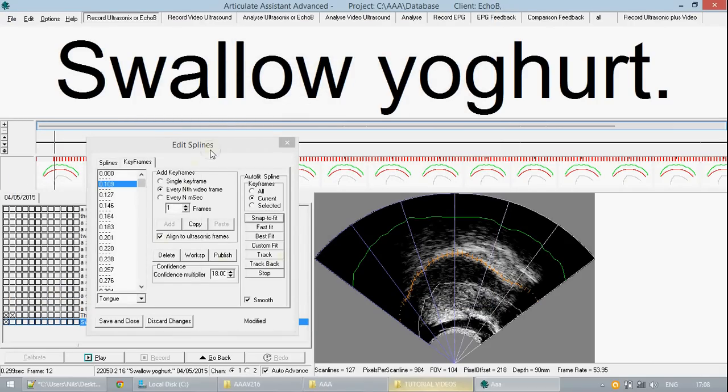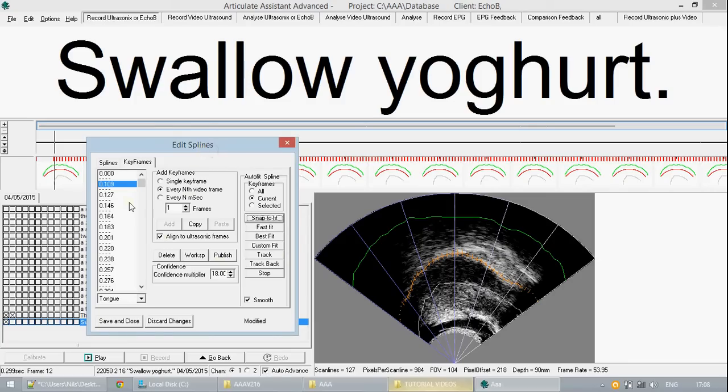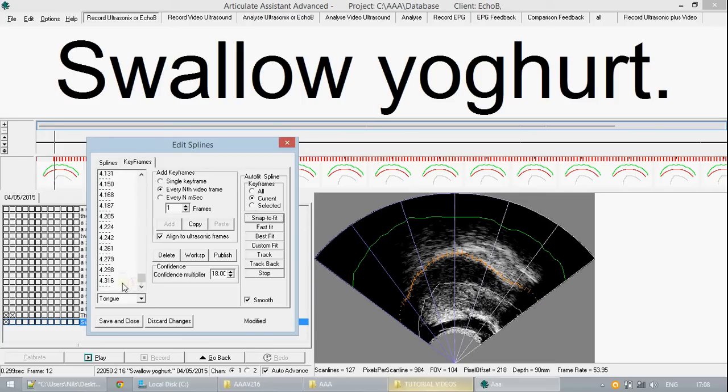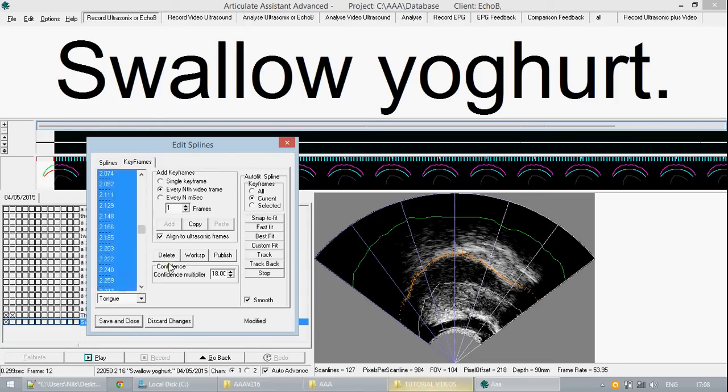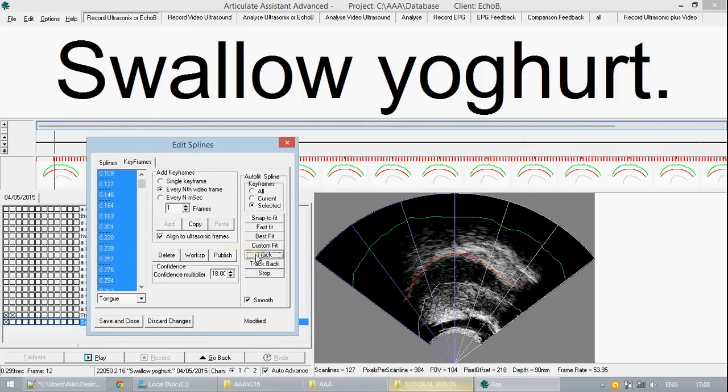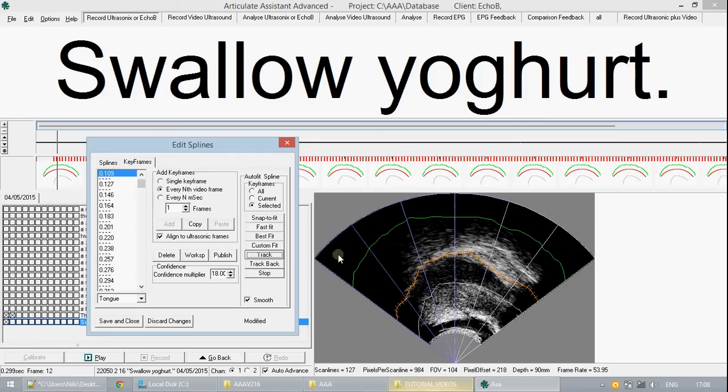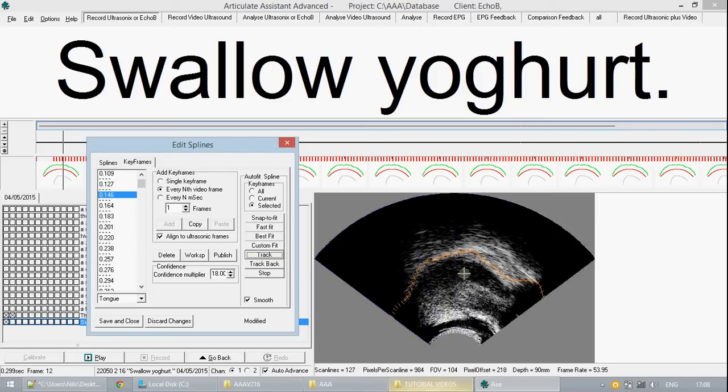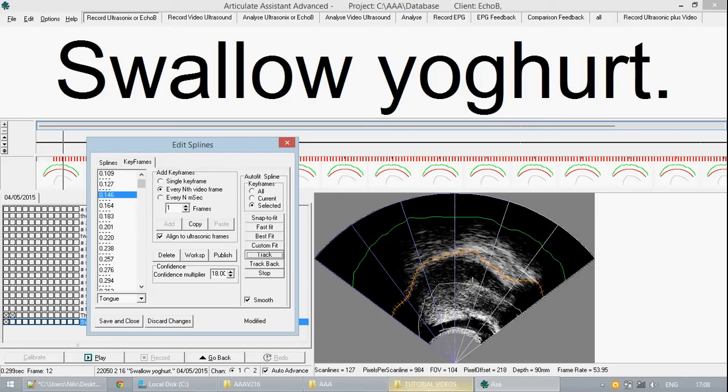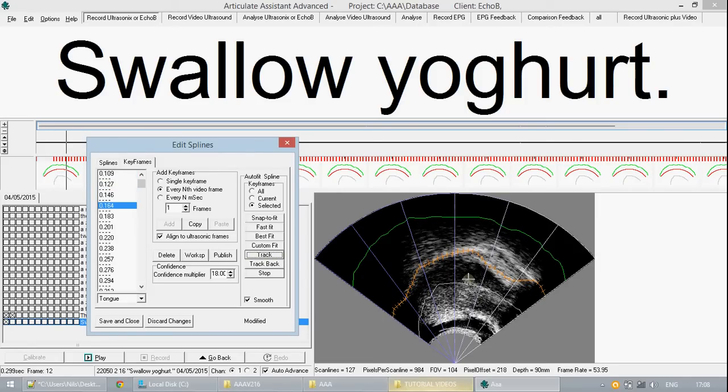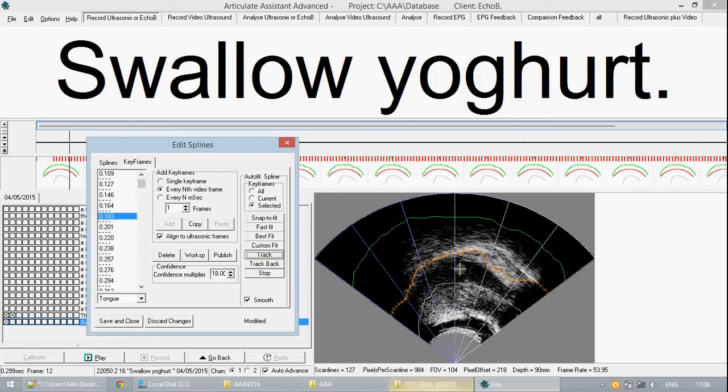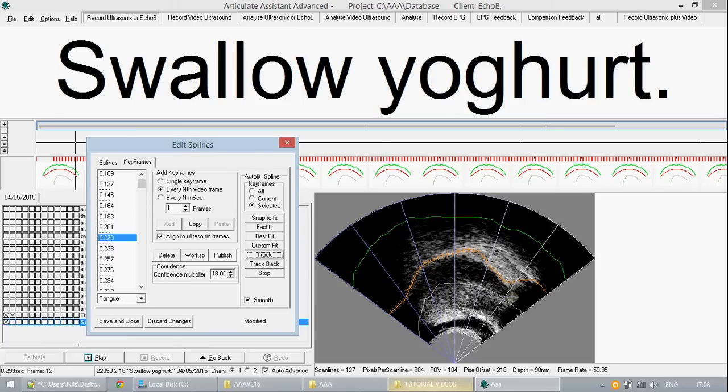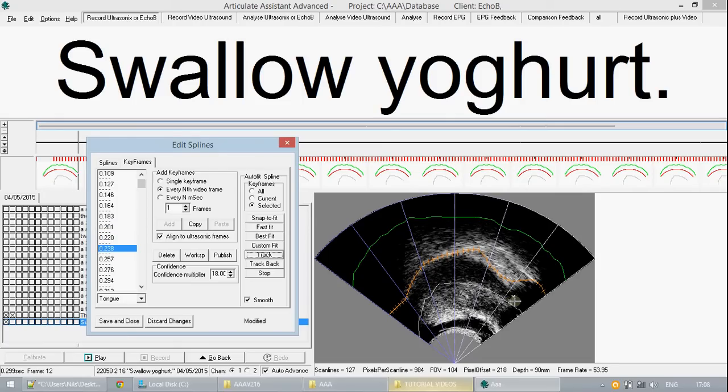So now that we have done this and we have made our initial tongue contour we can then select every frame that we wish to track across and press the track button. If you watch the ultrasonic image here you can see the software calculating each subsequent frame and moving the contour of the spline to try and best fit the shape of the tongue.